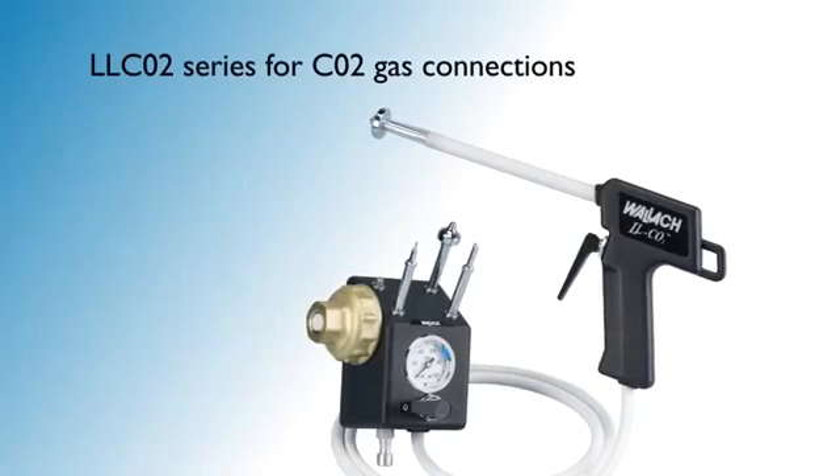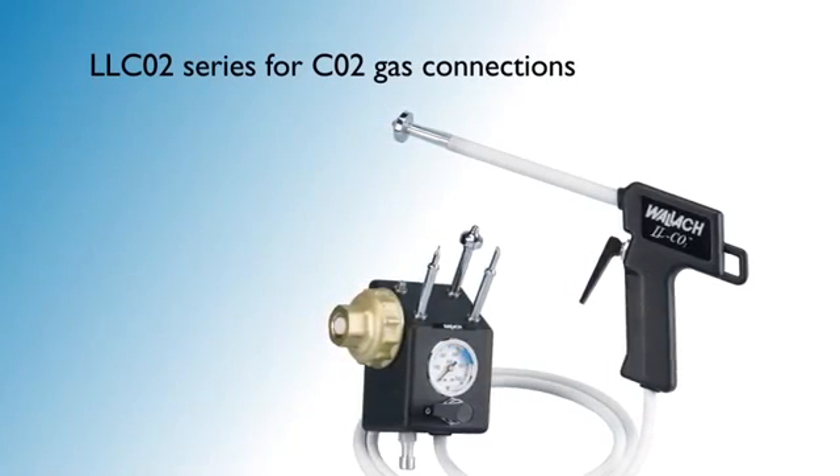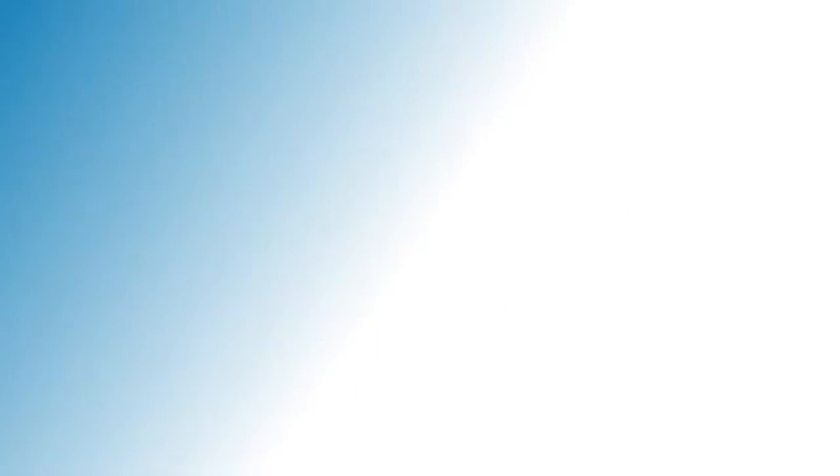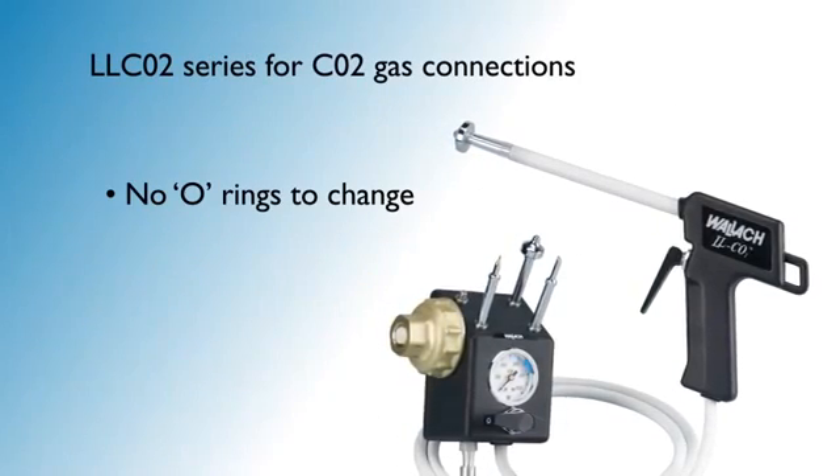The Wallach LLCO2 is optimized for use with CO2. It also provides an excellent freeze and uses the same large selection of sterilizable cryosurgical tips as the LL100. Like the LL100, there are no O-rings to change.